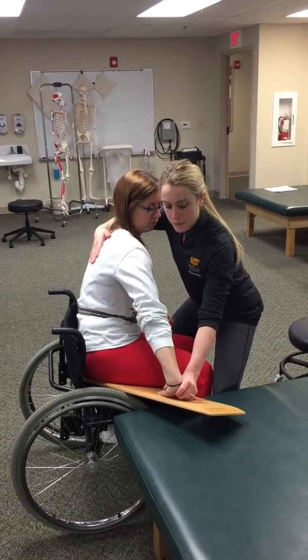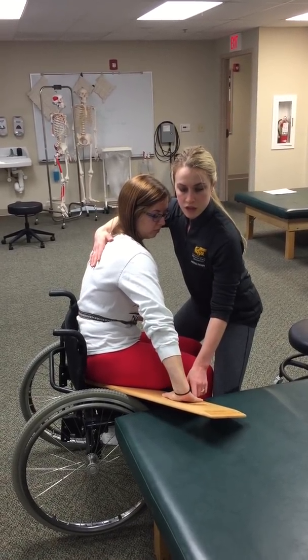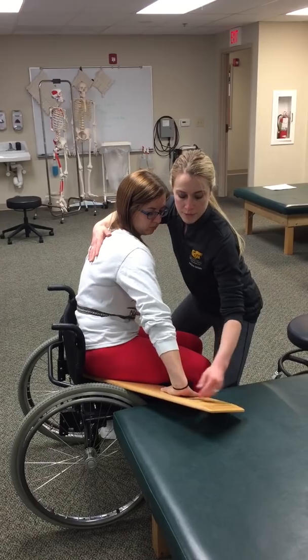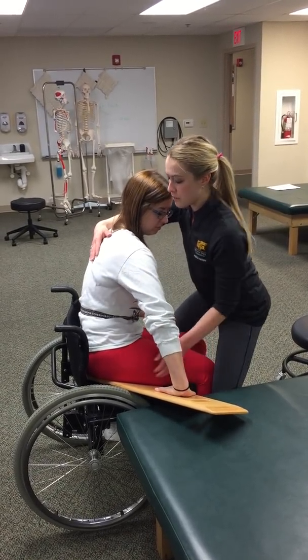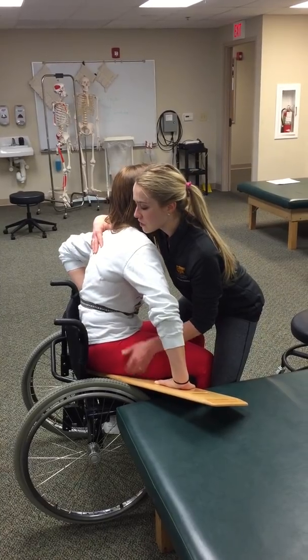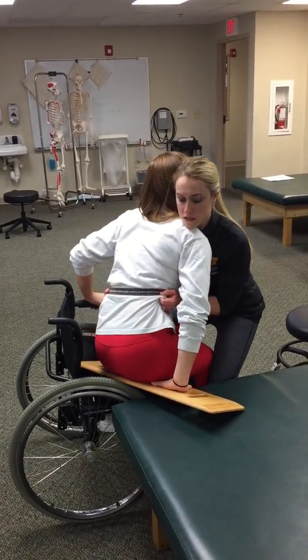Okay, so now that I've got the board underneath her, I'm going to have Claire reach for her hand. I'm actually going to turn her hand under a little bit just to give her a little bit more support. This also discourages her from reaching in and grabbing on the handle or grabbing on the outside of the board here. Then we're going to have her lean over to this side, and I'm going to use her gait belt in this case, and I'm just going to slide.